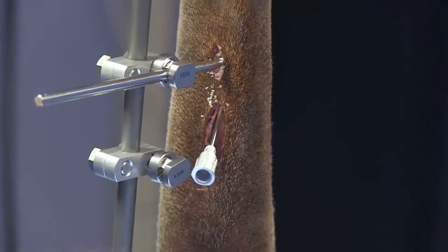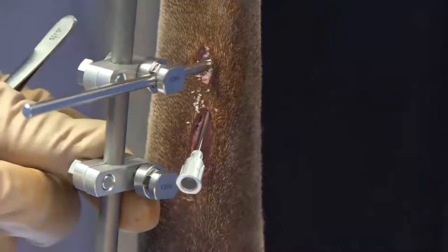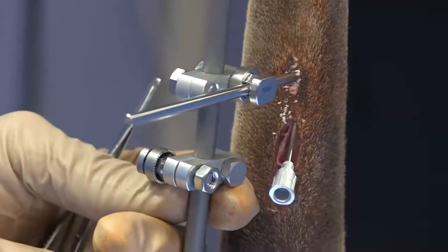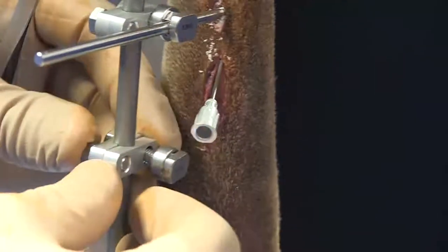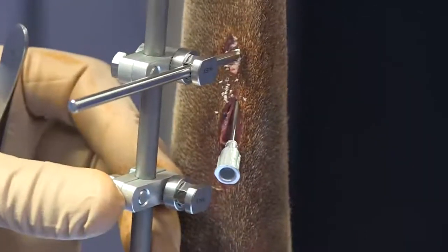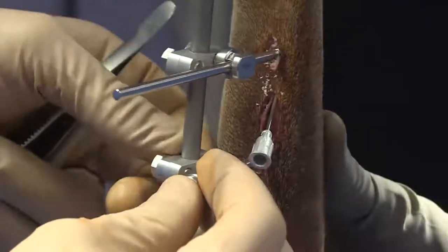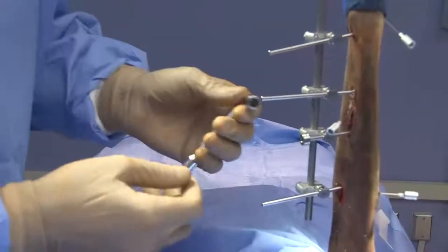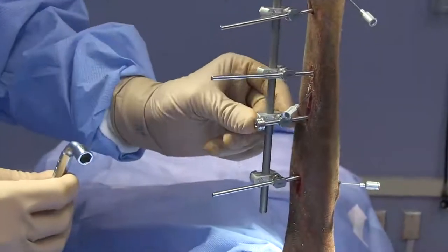To optimize the stability and rigidity of your construct, it's preferable to have your clamps placed adjacent to the bone. Having the clamp positioned away from the bone places your fixation point further from the axial orientation of the bone, which weakens the rigidity of your construct. Keep that in mind if you're pre-placing these. We can go ahead and use the drill sleeve here — snug it down just a little bit. The beauty of it is you can hold it in position while you pick up your drill. If the clamp is moving around, take your wrench and snug down that bolt a little bit.